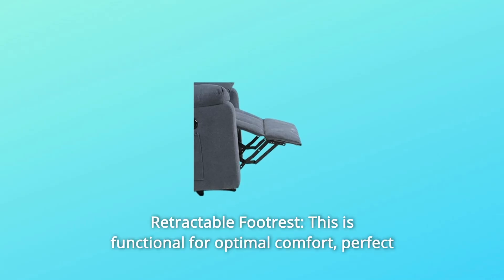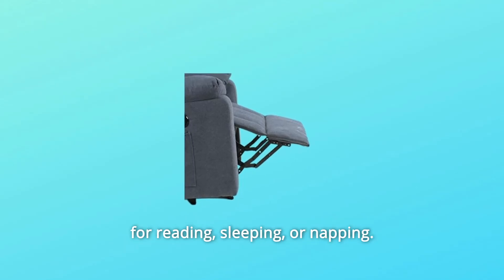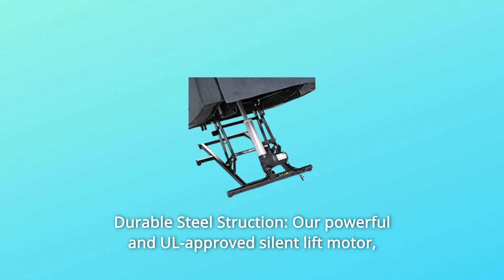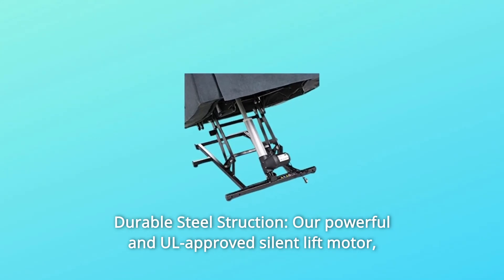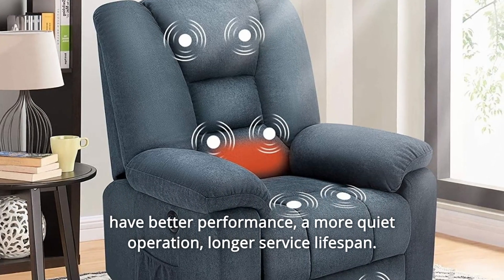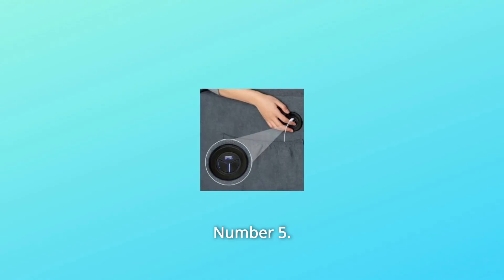Number 3: Retractable Footrest — this is functional for optimal comfort, perfect for reading, sleeping, or napping. Number 4: Durable Steel Construction — our powerful and UL-approved silent lift motor has better performance, a more quiet operation, and a longer service lifespan.